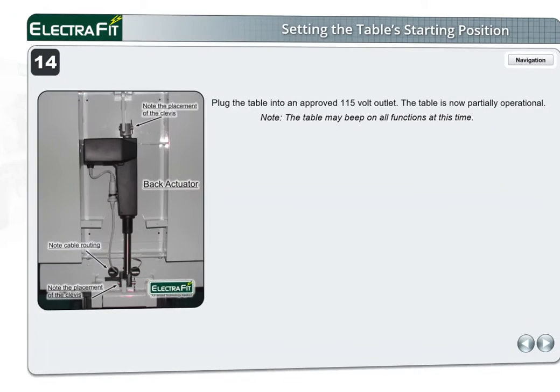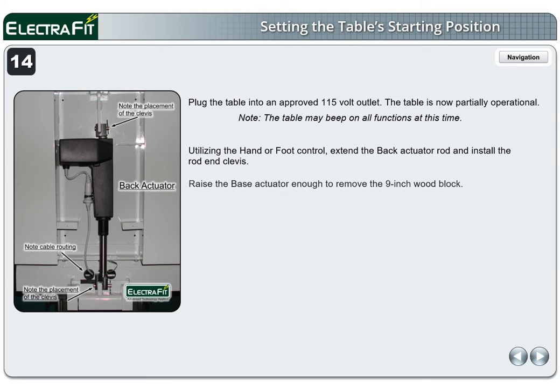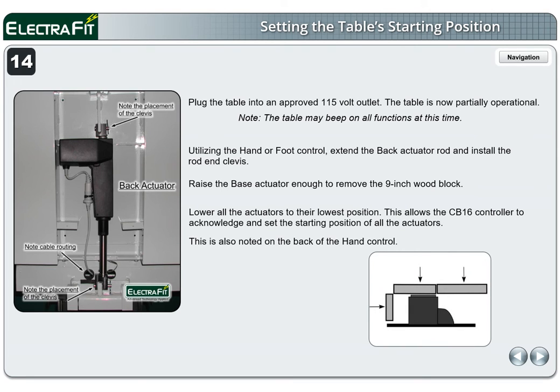Page 14. Plug the table into an approved 115-volt outlet. The table is now partially operational. Note: the table may beep on all functions at this time. Utilizing the hand or foot control, extend the back actuator rod and install the rod end clevis. Raise the base actuator enough to remove the 9-inch wood block. Lower all the actuators to their lowest position. This allows the CB16 controller to acknowledge and set the starting position of all the actuators. This is also noted on the back of the hand control.